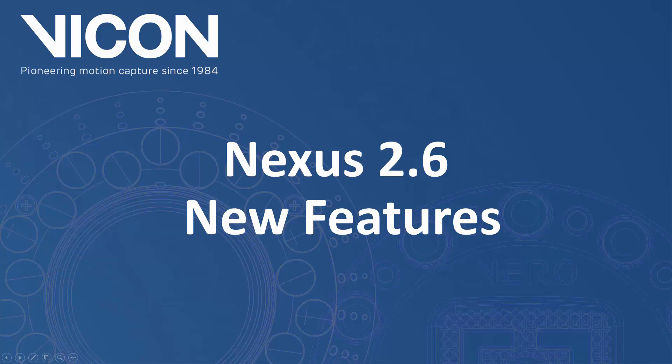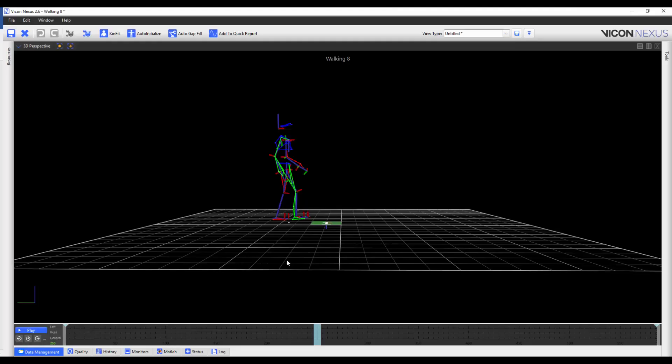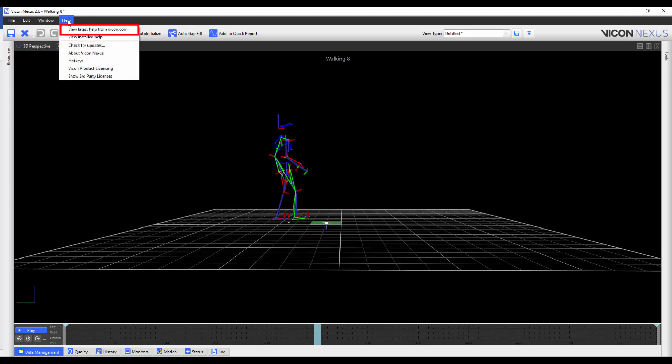Welcome to the Nexus 2 Help Guide. In this video, we will be discussing the new features of Nexus 2.6. You can find the list of features by pressing the Help button and then selecting View Latest Help from Vicon.com.